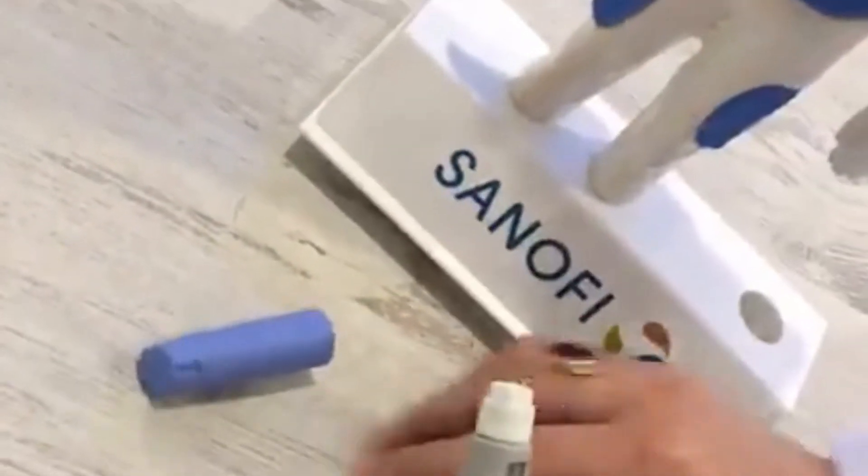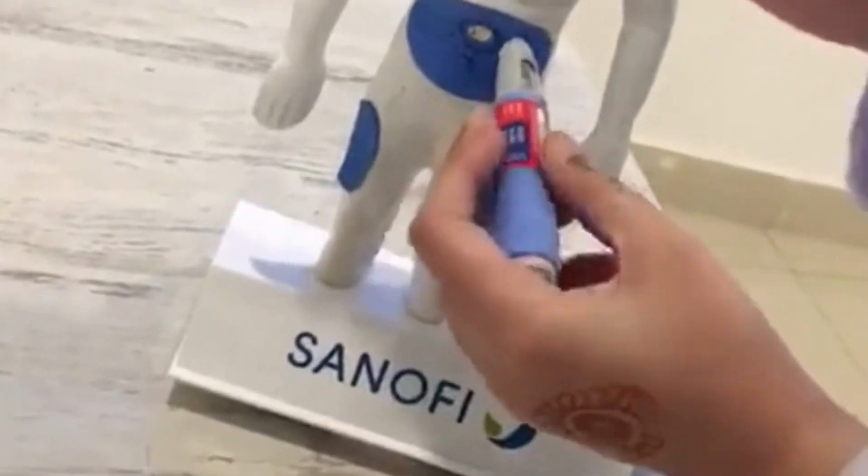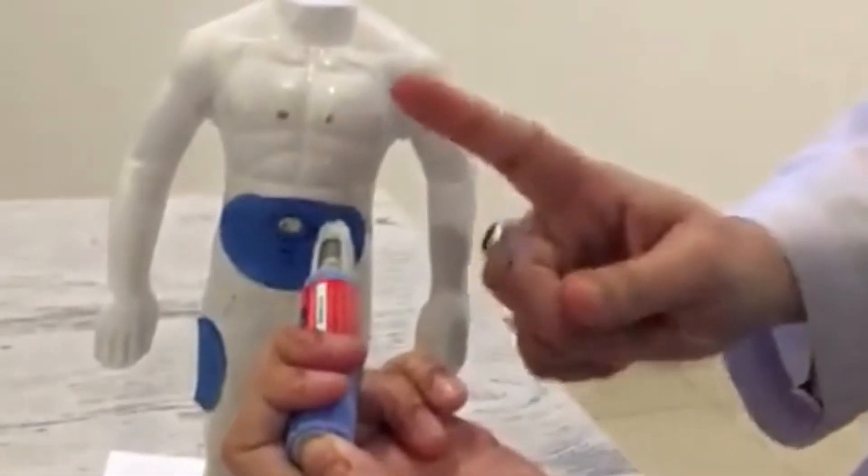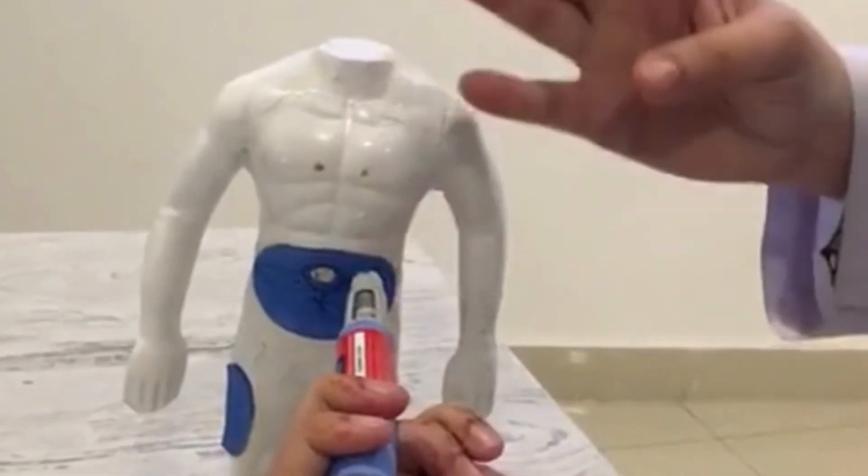Now remove the protective cap from the needle and inject the dose on the abdomen subcutaneously. Then hold the pen and wait for 4-5 seconds until the whole drug is absorbed.